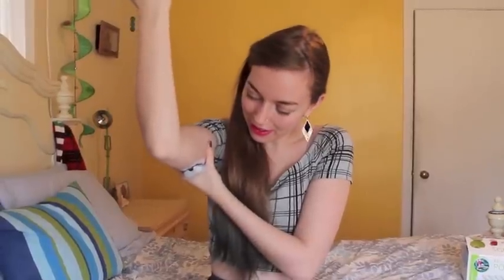I can never tell if it's really going to hurt or not. It just usually feels like a pinch if it does hurt. So we'll see what happens. It's good to put your hand on it and have a firm hold. Okay, that was actually not bad. I didn't really feel that.